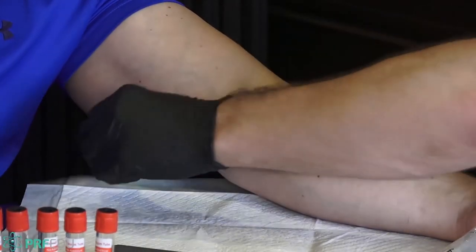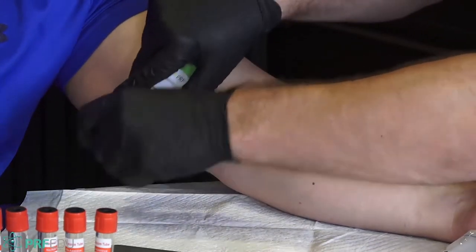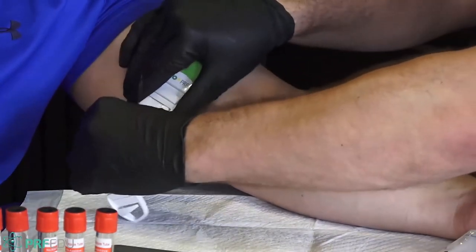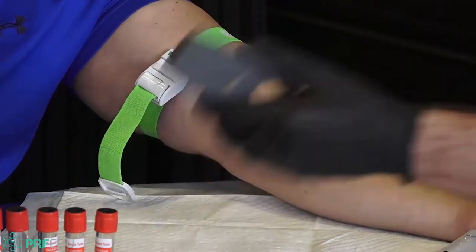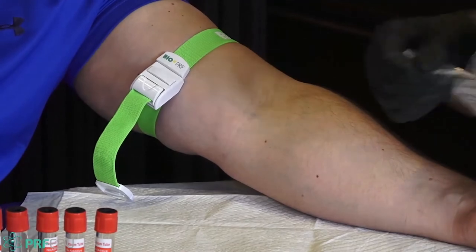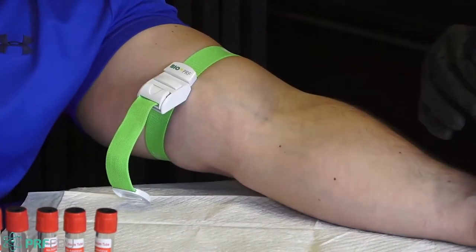The tourniquet, we always tie typically 3 inches above, okay? So Carlos has probably got the biggest arms I've ever had to draw from, so this is fitting quite tight. So then you can see, and you can actually feel that vein that's popping out a little bit. You can ask him to do a couple pumps. With the butterfly needle, okay, as we went over, bevel is always facing upwards, okay, when we're doing this.